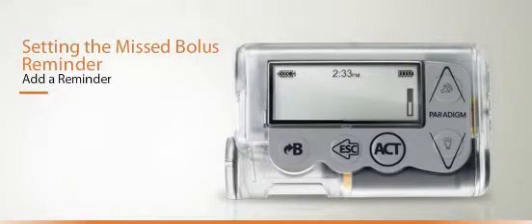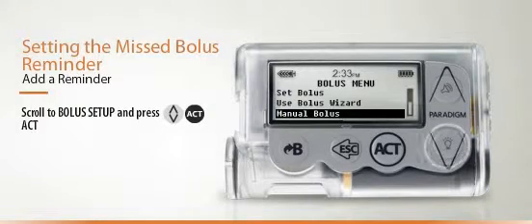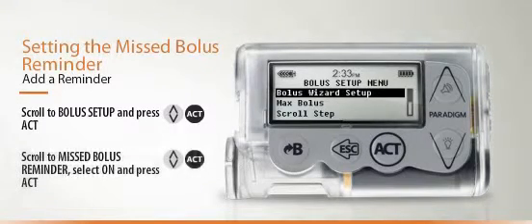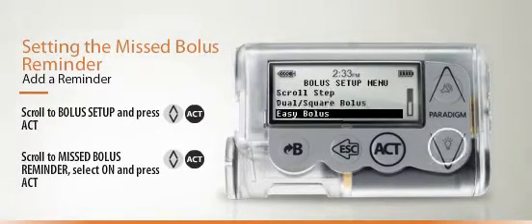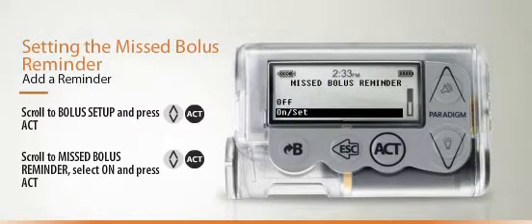For your safety, the Paradigm Veo allows you to set up missed bolus reminders. To activate this feature, scroll to Bolus Setup, then press Act. Scroll to Missed Bolus Reminder, select On, and then press Act once more.